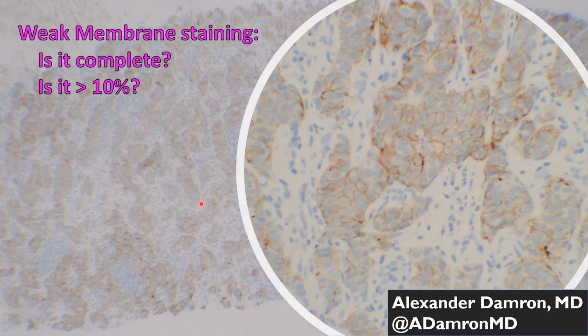And this is actually the lymph node that goes along with the previous slide. So the previous slide was the breast excision on this patient, and this was the axillary lymph node with an axillary met that was predominantly 1+ staining, right? And as I looked throughout this lymph node, there was enough of this that I thought there was enough greater than 10% to say, you know what, let's go ahead and test this too. And the reason I say that is she's got clearly 2+ staining in the breast, and then I have some 2+ staining in the lymph node.